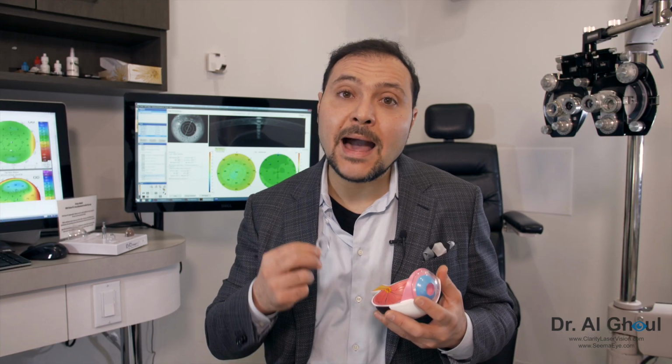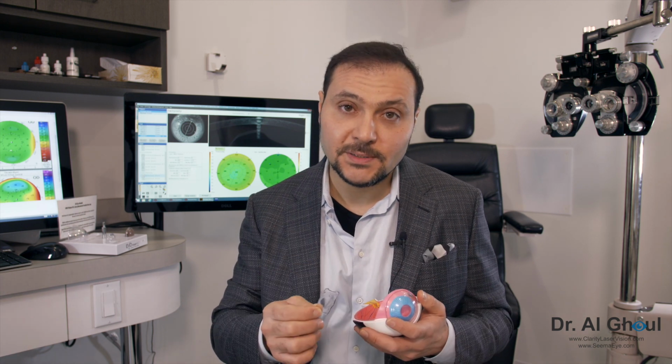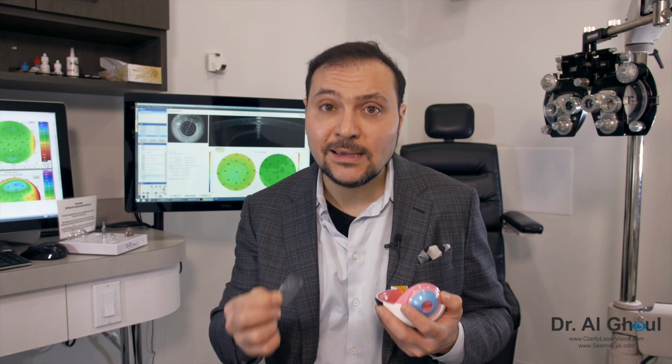It's really great for patients who have been told previously they're not good candidates, either because the technology wasn't there or because their corneas are not suitable. And certainly we can talk a lot about who are good candidates and who are not later. All right, so let's talk about why I like the Visian ICL in particular for my phakic ICL patients. Again, the concept of an ICL is that it's a lens that you can put in the eye, and for whatever reason, either due to potential complications or patient satisfaction, you can take it out, and most of the time it creates no issues from the point of view of the patient outcome.